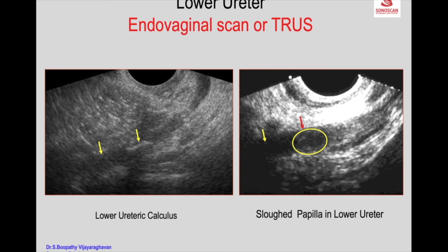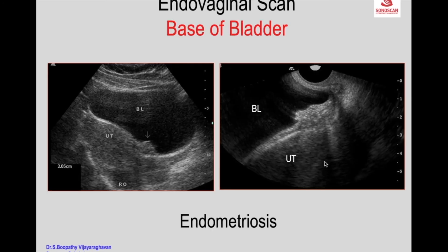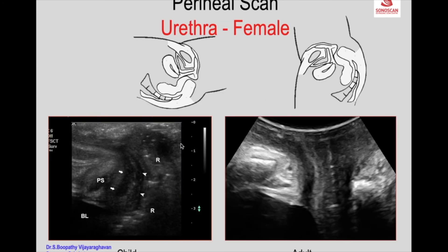That is well seen — you see the uterus and bladder with an irregular mass at the level of the lower segment cesarean scar, with loss of interface between the uterus and the bladder, and an irregular mass protruding into the bladder. You see the pubic symphysis, the bladder, and the urethra, then the vagina and the rectum. In both a child and an adult, you can see the pubic symphysis and the urethra as an echopoor structure just beneath the pubic symphysis from the urinary bladder, and the vagina.